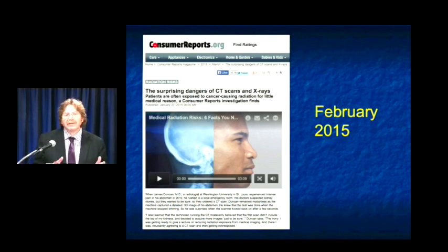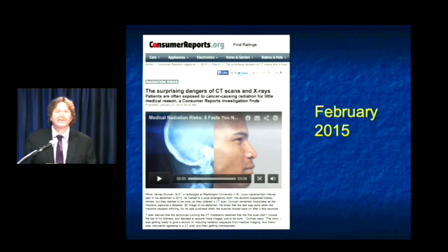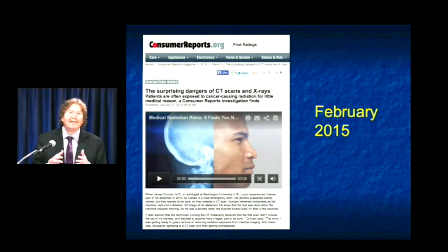So it's something that we're just not going to get around, and I think as radiologists, it's very important for us to know enough about radiation that we could be good informers to our consumers, to our patients, about what the risks are, and to really make sure that people understand that we are minimizing the risk to them, and the amount of information gained is indeed substantial.